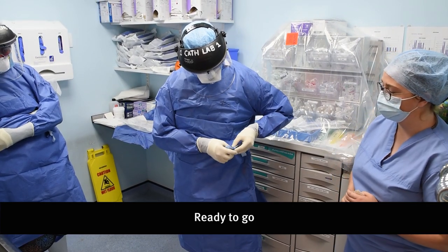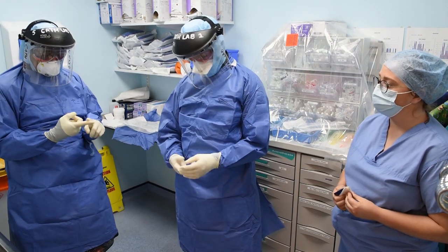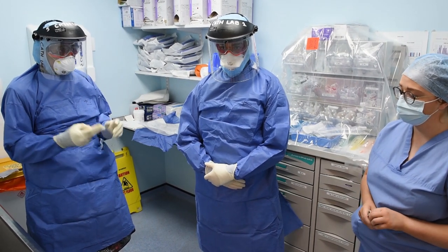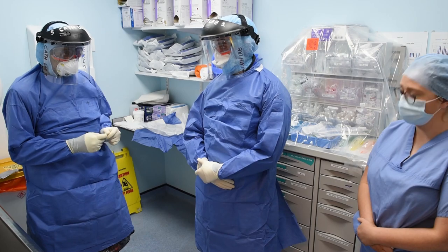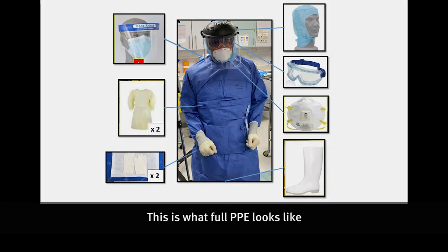Okay, so we're ready to go. We'll obviously need the physiologist and the nurse ready in a similar way — with leads on and double gown, but not sterile. Fantastic, let's go.